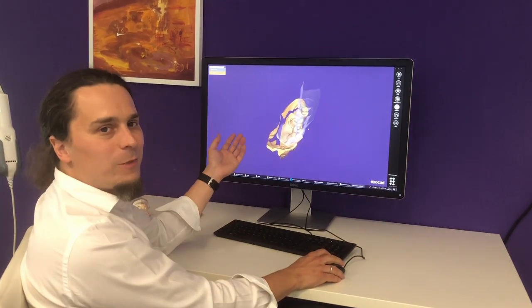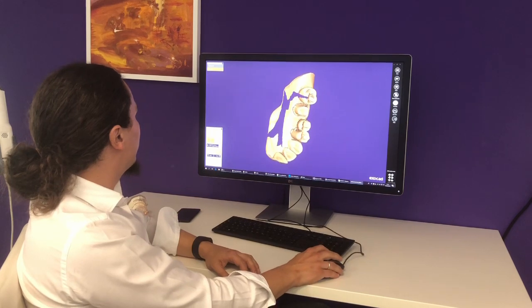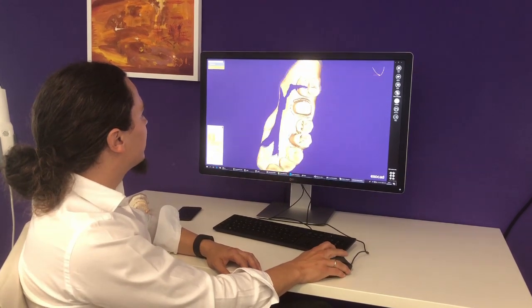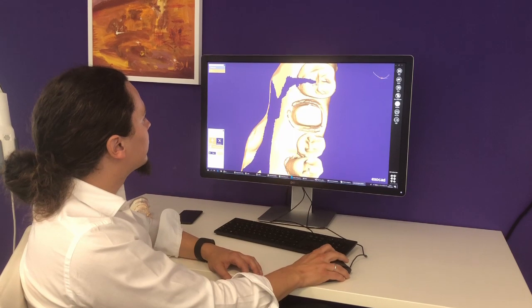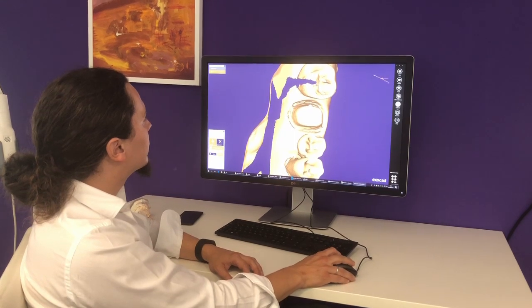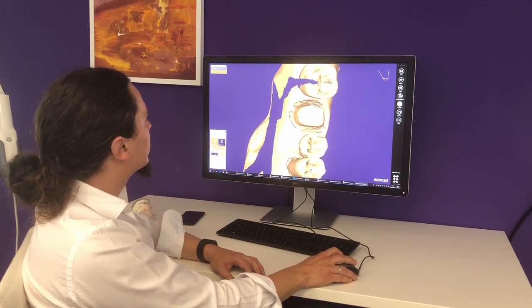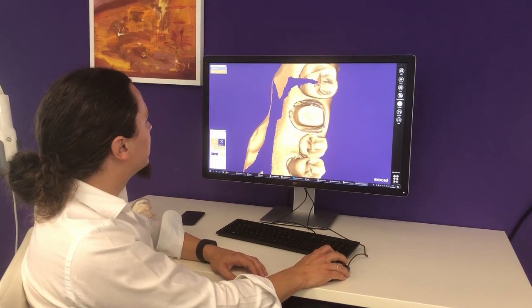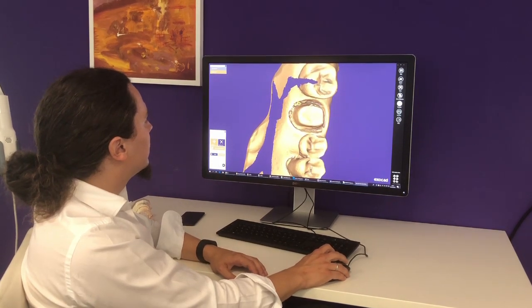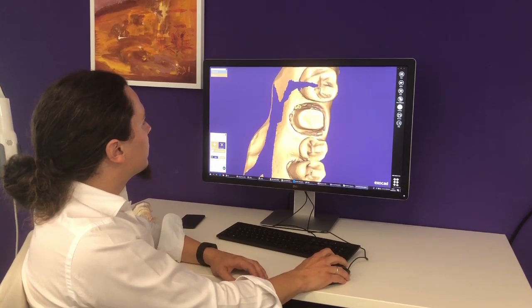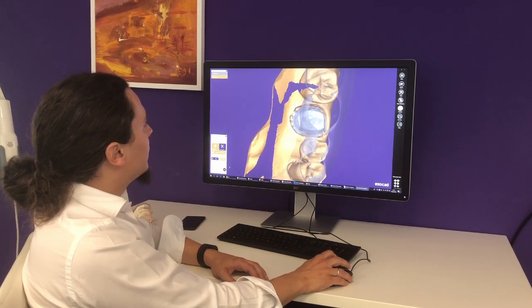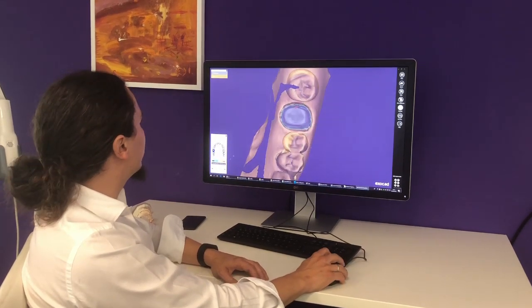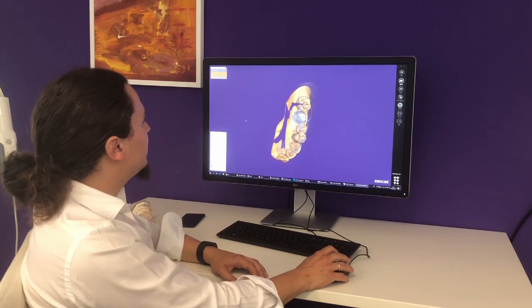The software will now automatically load the scan data and we proceed with the margin line detection. I quickly confirm the insertion axis — looks fine to me, so let's proceed.